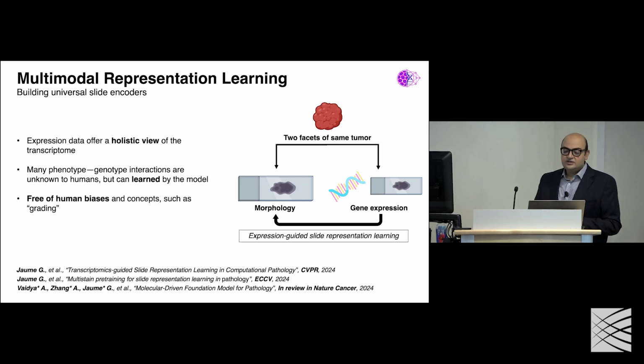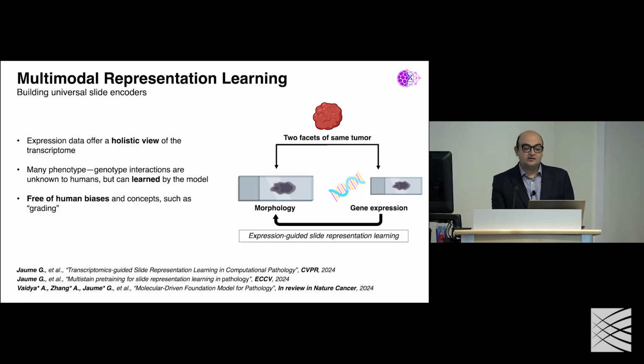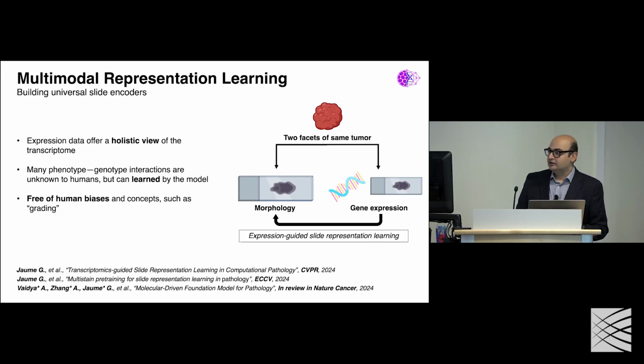So just in light of that, there's a lot of other data in pathology that you could be contrasting with, right? So we show that you can contrast with text to improve representation, but there's also morphologic data, molecular data, and also immunohistochemistry, radiology, other kinds of data that you can contrast with to potentially improve image representation.